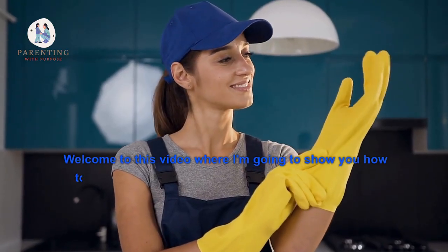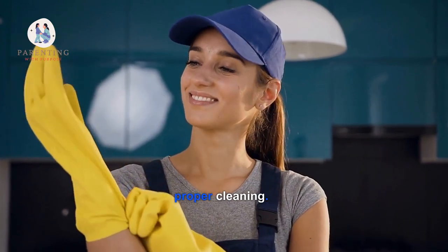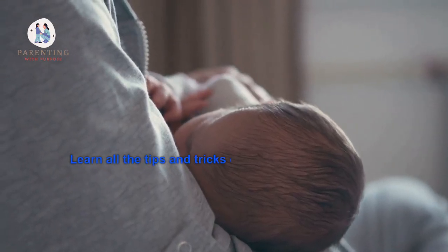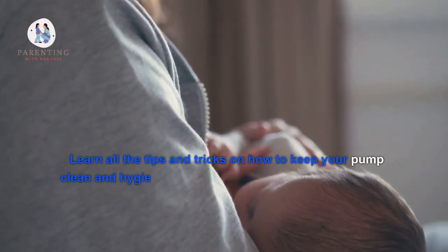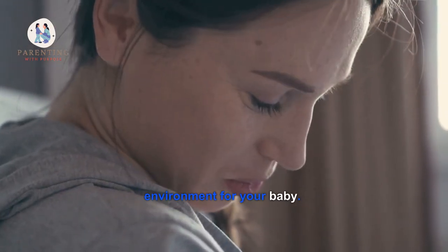Welcome to this video where I'm going to show you how to get the most out of your breastfeeding pump with proper cleaning. Learn all the tips and tricks on how to keep your pump clean and hygienic so that you can ensure a safe, healthy environment for your baby.